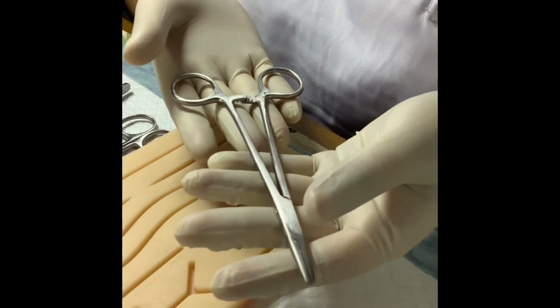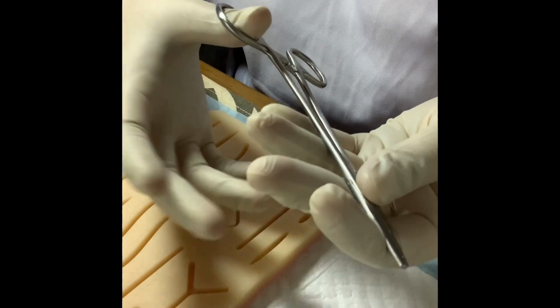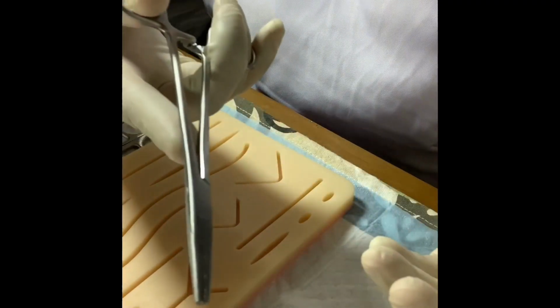First, we will be using a needle holder. Use your dominant hand while holding it. Place your thumb finger on one handle and the ring finger on the other handle and the index finger here for support, and hold it like this.